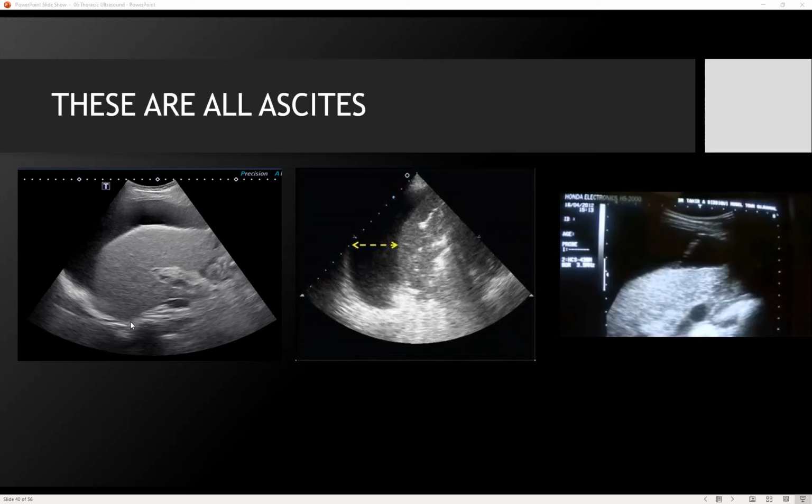So if you're not sure, you have to keep scrolling. Now, if you had scrolled up with your probe, you would have found where this diaphragm hit the wall and went above it, and you might have found that this patient does not have a tappable pleural effusion. Here also, you could say, oh, I found theoretically a costophrenic angle, but again, there's no thick diaphragm overlying. You might see this, which is potentially a diaphragm, and you have to scroll up to make sure. Or maybe that's some collapsed lung that's floating in space. In theory, it could be possible, but it's not likely because you don't have the thick overlying diaphragm. Still, you have to scroll up and find the lung and find the diaphragm.